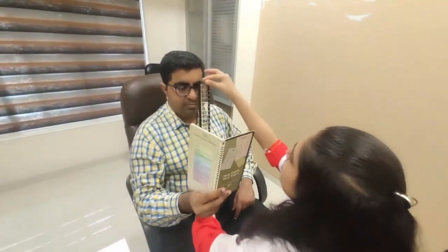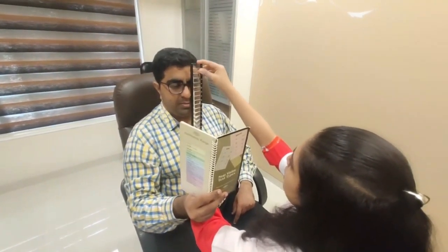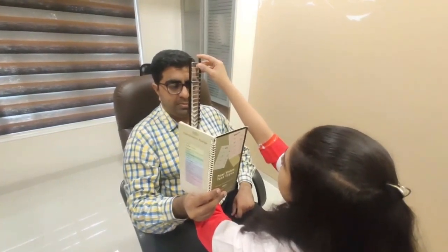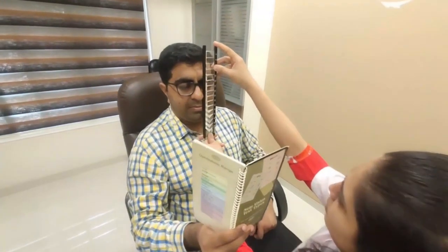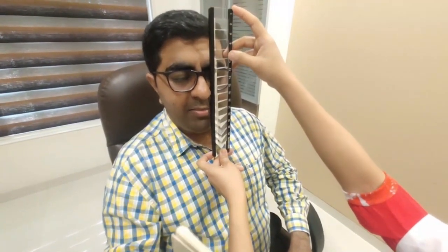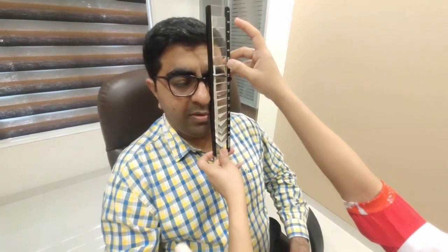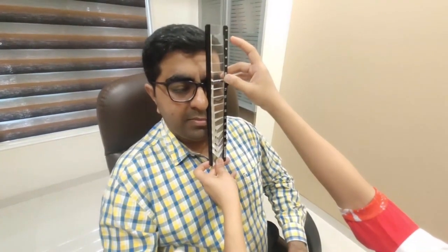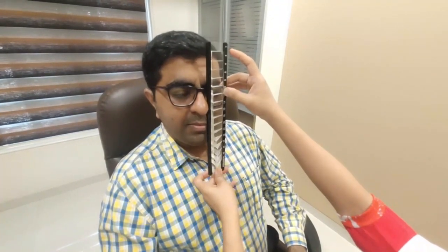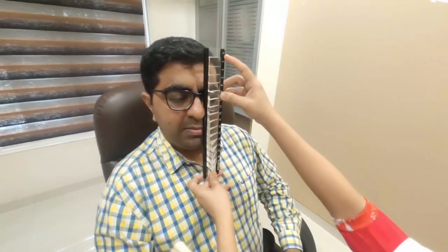Clear? Yeah. Clear? Yes. Clear? Blur. Blur? Yeah. Okay. Is it 1? Yeah, but blur. Single? Yeah, sort of, but very, very blur now. The earlier one, yeah, this is sort of double. Double. Okay. Single? Yeah, again blur, but this is more double now. Single? Blur. Single? Yeah, single. Clear? No, blur. But it is single.